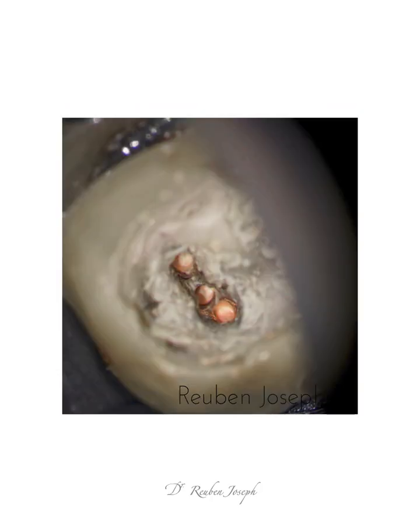The third thing you can do is delay taking the picture until you complete the obturation. The GP inside the root canal space is going to do the same job your sealer and the calcium hydroxide did as mentioned in the earlier slide. It's going to throw back a lot of light and the information inside the canal space is going to be a lot more evident. Here you can clearly see that there are three separate orifices, and also that these three orifices are present at three different levels. You can clearly see that the middle mesial is actually a lot lower than the other two main canals.